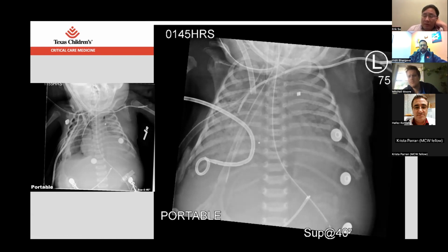And the lung looked awful when we sucked out the air, but this kid actually got off of ECMO in about 2 weeks. So this was a little bit of a chest drain to the extremes, but this was what we did when we tried to do it under direct guidance, and it worked really, really well for this kid.